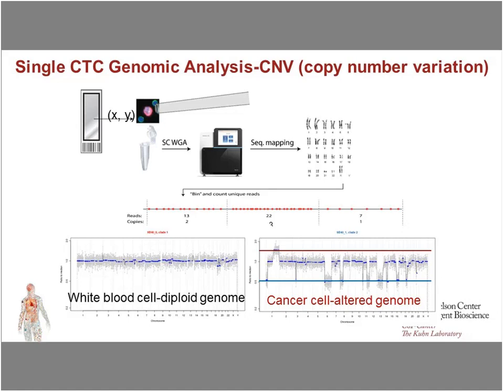Somatic copy number alterations in single cells are always numerical aberrations. The upper red line marks 1 copy more on 1q, while the blue line on the bottom indicates all these deletions are exactly 1 copy less than diploid. This numerical stepwise alteration provides us a reference to calculate the tumor fraction of cfDNA, which I will explain more later.